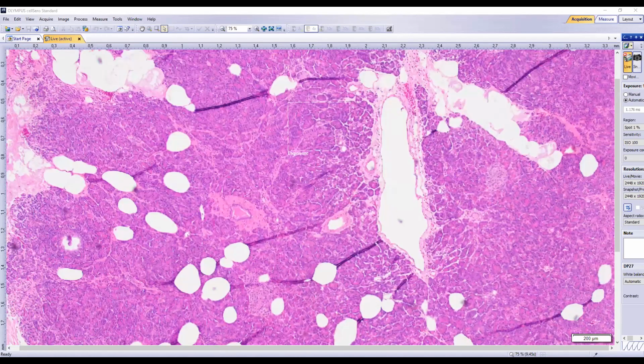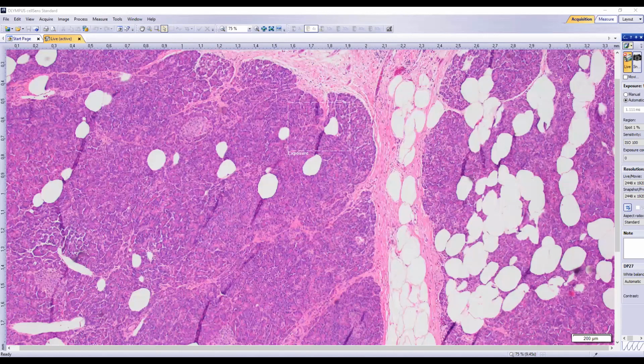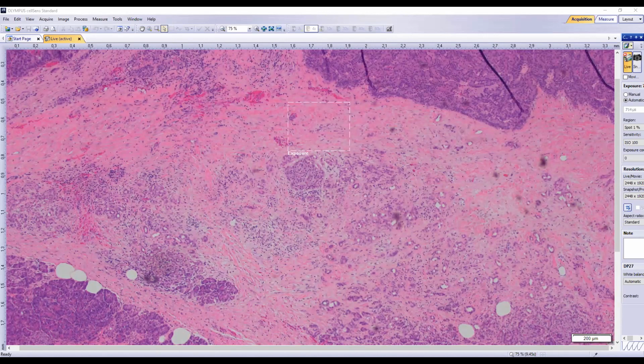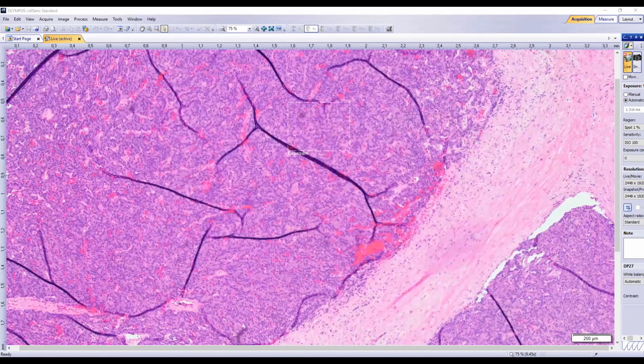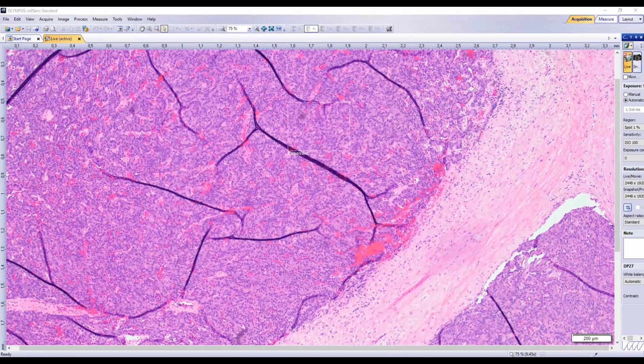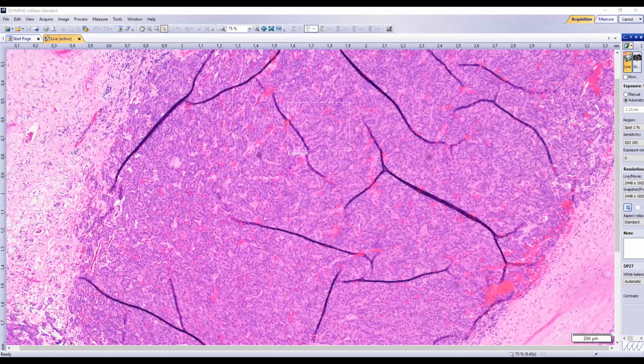Like I said, the workup for pancreatic lesions is pretty similar. On imaging, if they see a lesion, then they try to characterize how it looks on imaging. And then they try to do either a needle core biopsy if it's a solid lesion, or an FNA if it's a cystic lesion. And this one, because it was focally cystic, they tried to do an FNA.